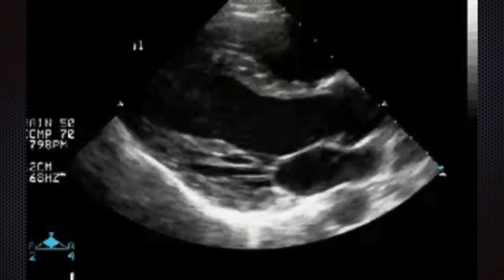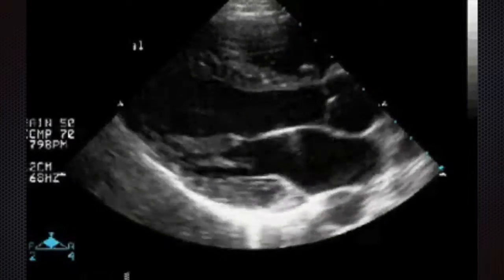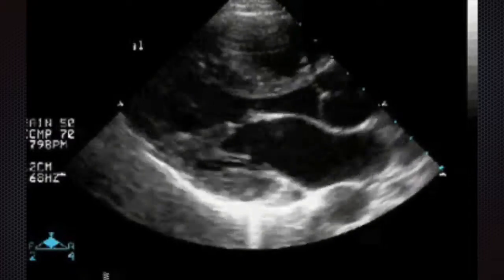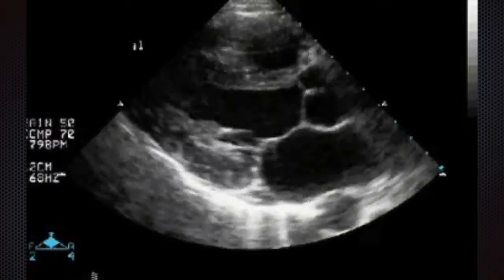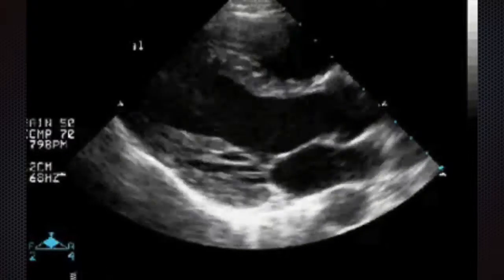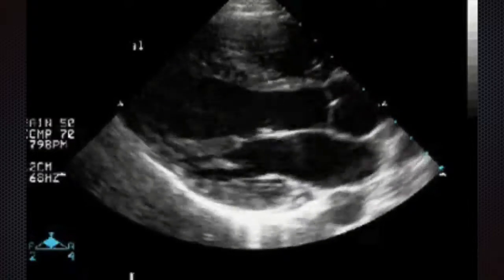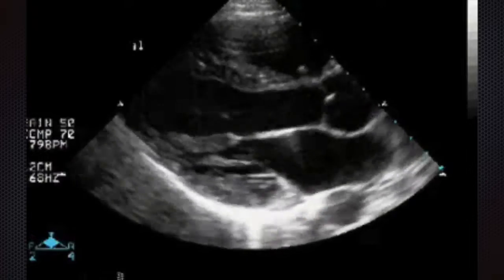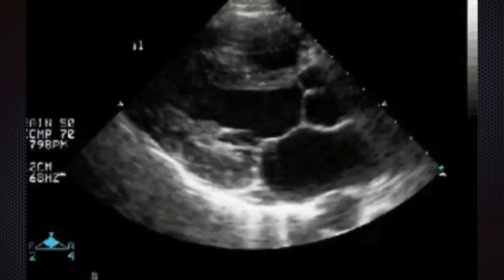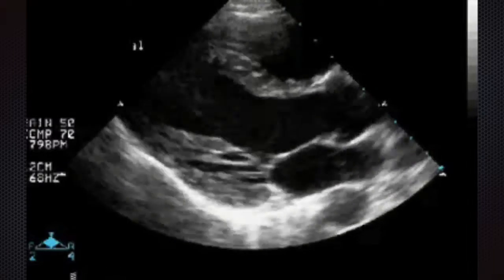So there are papillary muscles making the actual border of the posterior part of the heart on the bottom left, difficult to totally appreciate because of the chordae and papillary muscles around it. But on the whole, the left ventricle muscle, if you think about it, should be in its relaxed phase, i.e. when it's not contracting, about a centimetre. It ranges between about 9 and 12 millimetres, but a centimetre is a good rule of thumb.